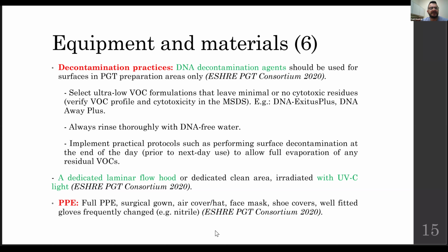Always rinse thoroughly with DNA-free water, and also you can implement some practical protocols, such as performing the surface decontamination at the end of the day prior to the next day's use to allow full evaporation of any residual VOCs. Also, a dedicated laminar flow hood or a dedicated clean area with UVC light is recommended. And finally, full PPE, including surgical gown, hair cover, face mask, shoe cover, and well-fitted gloves frequently changed, is mandatory.